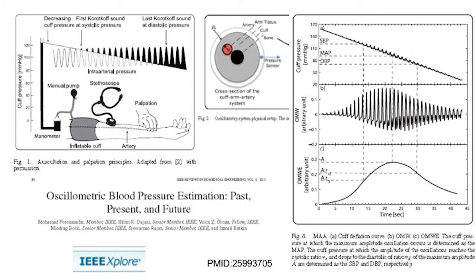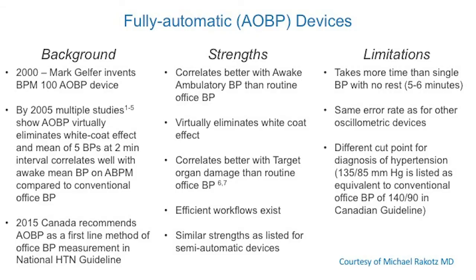There are 6 others. So the issues with oscillometrics are that they have widespread usage. They're a little easier in many respects. You don't have to have the hearing. You don't need multiple parts. You just need a cuff, hopefully connected to a device whose solid-state electronics are reasonable. So you can do it, especially on autopilot, with something they wear, like the ambulatory that you heard Dr. Vieira talk about just a little bit ago.